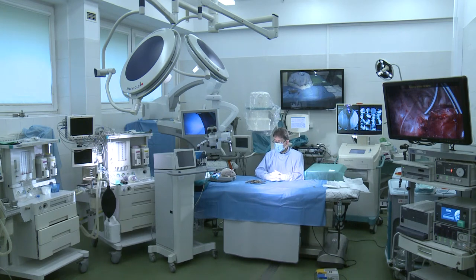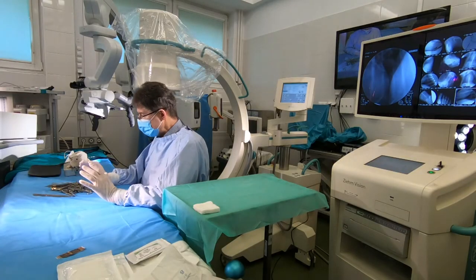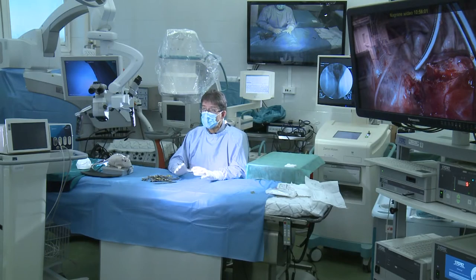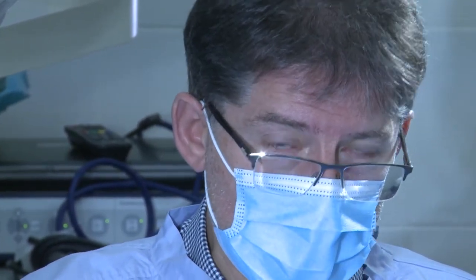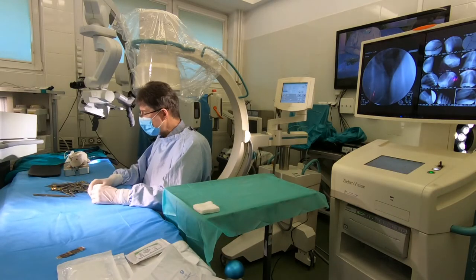Hello. In the second part, I would like to say some words about the instruments for surgery. Don't be surprised — it will be only a very basic surgical set for the most general experiments, both in studies and also in clinical practice.